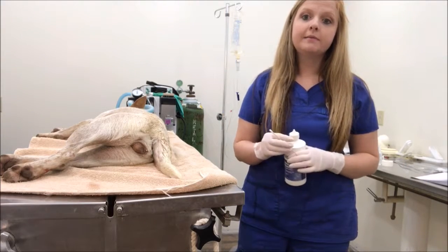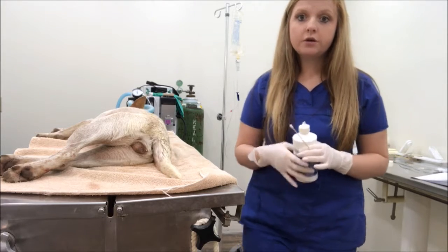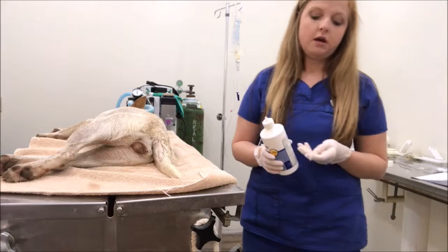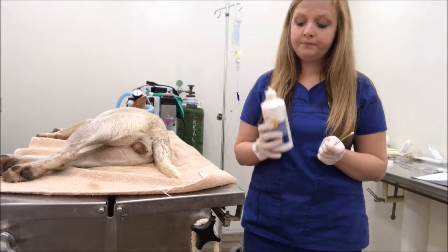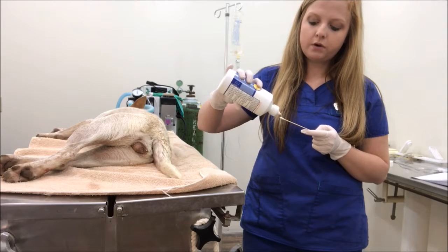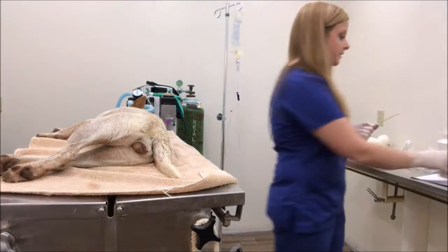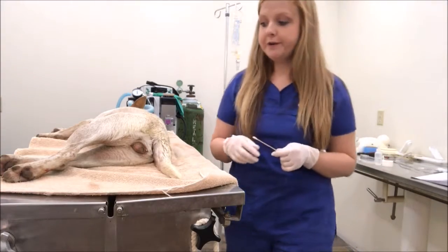Debbie Gray, and I'm about to go ahead and do a vaginal smear cytology. So the only things we need for this are a swab and some saline. So I'm just going to put some saline on the swab. And we're going to use Dixie here. Dixie is sedated for surgery.